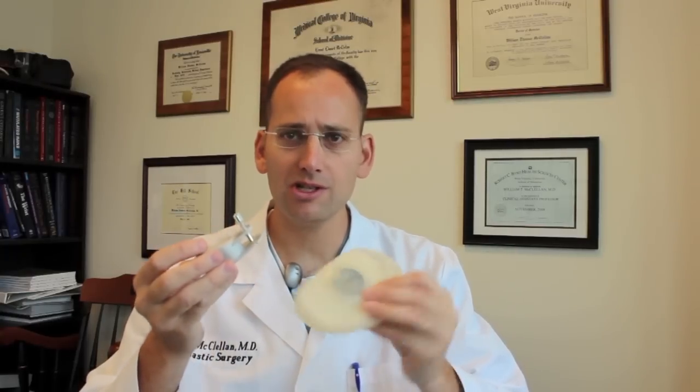The tissue expander comes in a kit with a little magnet like this, and the magnet is able to turn on a little stem. If this is under your skin, you move the magnet over the tissue expander — and you can see this moving as you go over the metal — and this in effect can find this port while it's under your skin.